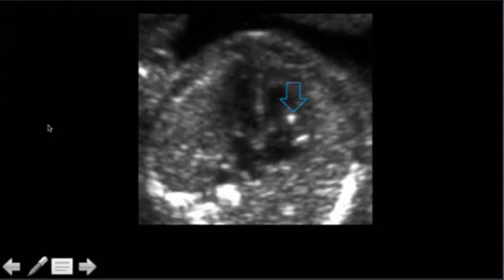Higher rate of trisomy 21 and 13 to a lesser degree, and it's supposed to trigger you to look for other features. It occurs in a normal population about 5% of the time, but you see it more in Down syndrome patients, around 12%. So it's supposed to make you say the patient could have Down syndrome, not that they necessarily do. It's a soft marker.